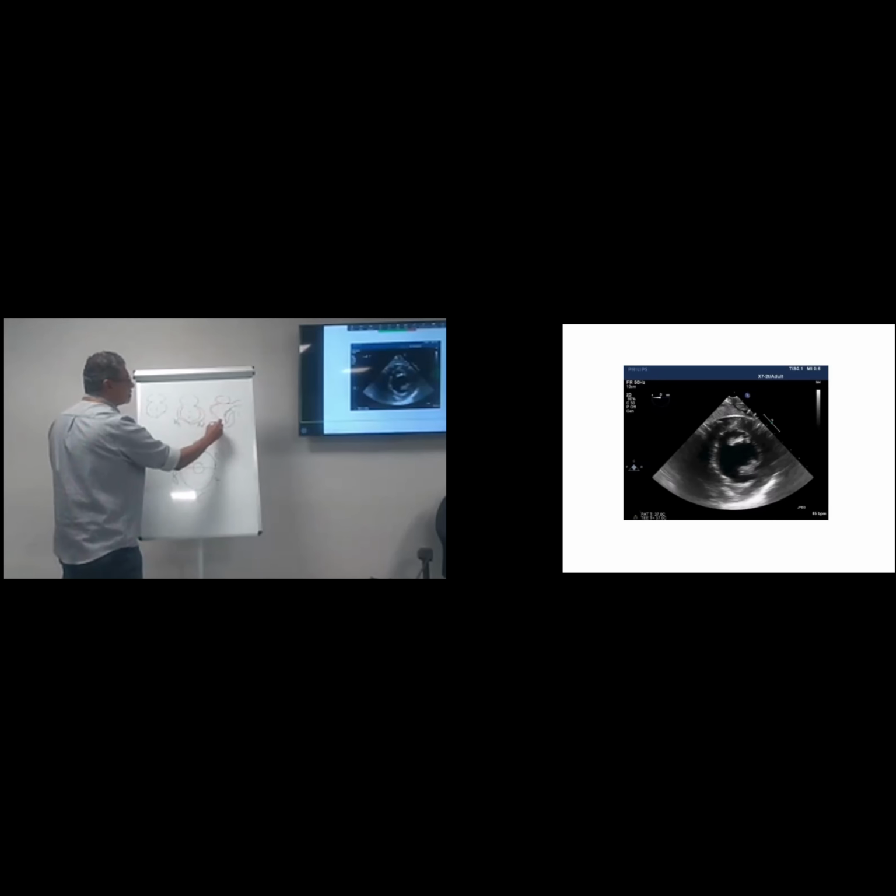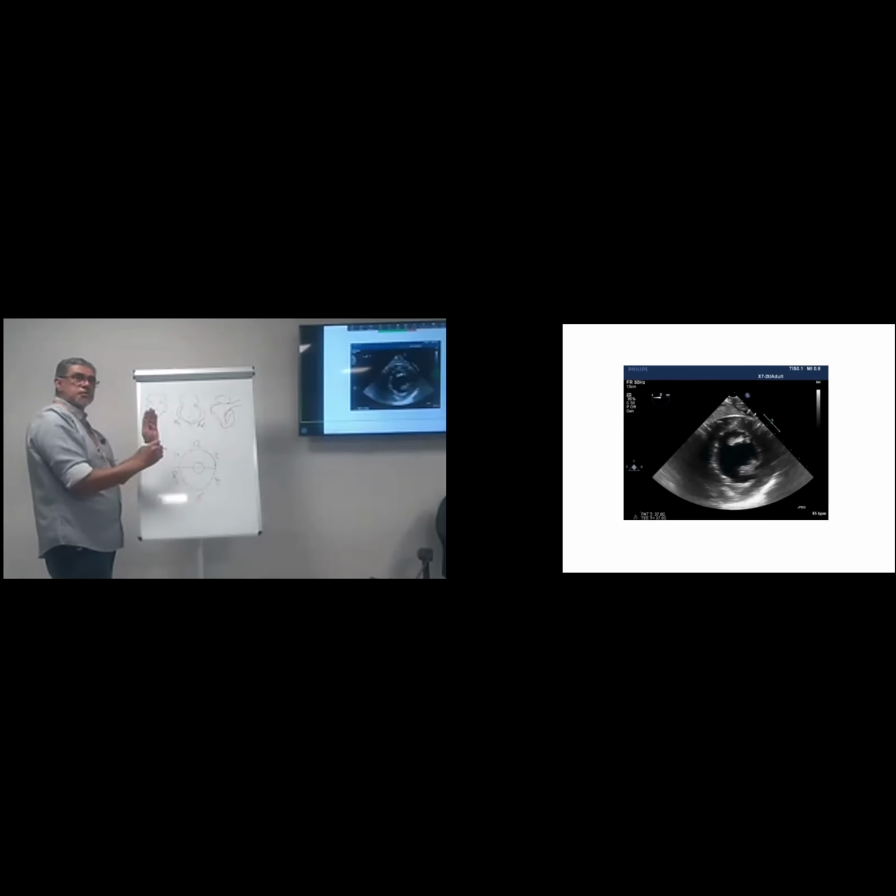My left hand is inferior, so inferolateral. Here my right hand is anterior, anterolateral. My left hand is inferior, so this is inferoseptal.